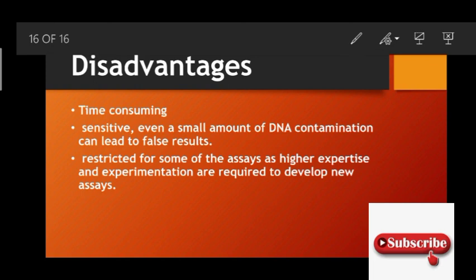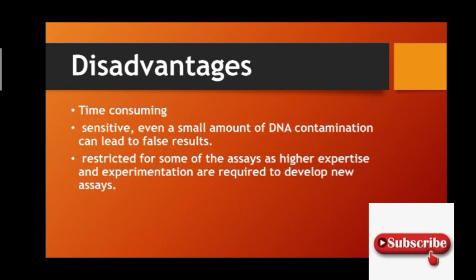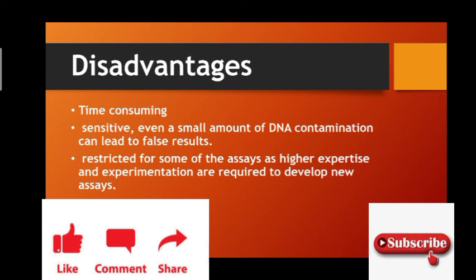So in this video, I discussed the reverse transcription polymerase chain reaction. This RT-PCR process is now very popular to diagnose a pandemic disease, COVID-19. In this video, I discussed the principle, the procedure, the application, and the advantages and disadvantages of RT-PCR, reverse transcription polymerase chain reaction.